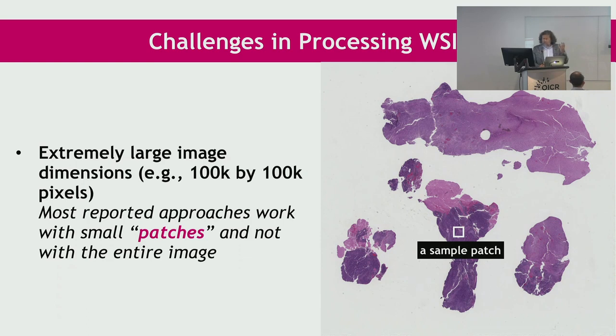So we need to figure out techniques, fast techniques. I was reading a paper, I will not mention where it was from, that was suggesting to do something with pathology images, and 400 computers were used to get the task done. Well, good luck with getting that type of technology into hospitals in the foreseeable future, because we don't have that type of infrastructure.